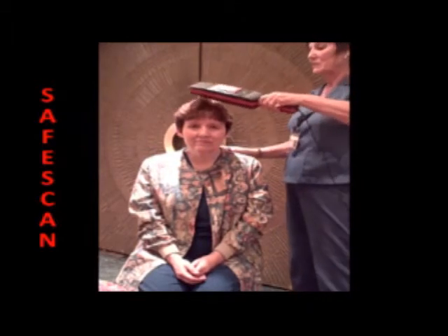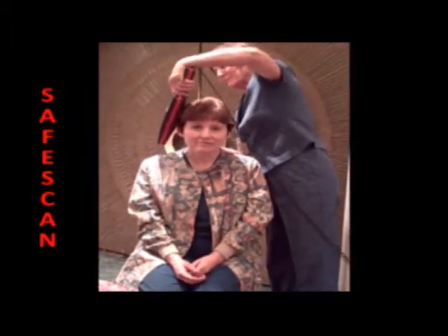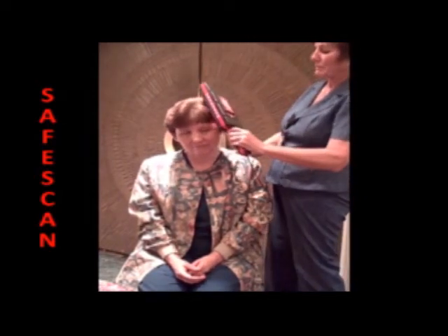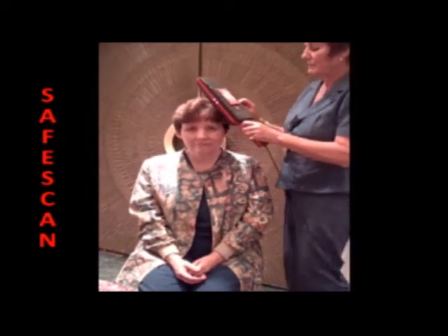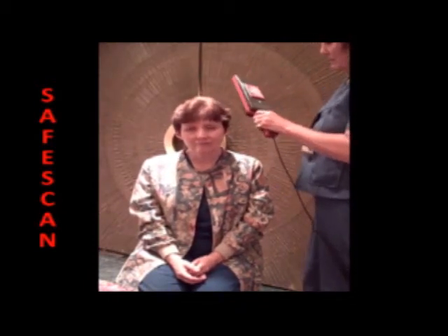An effective way to use the SafeScan target scanner is to begin with the patient seated. Then scan the hair area looking for bobby pins and other possible ferromagnetic threat objects, getting very close. Here a bobby pin has been found. Remove the bobby pin and then re-scan the area.